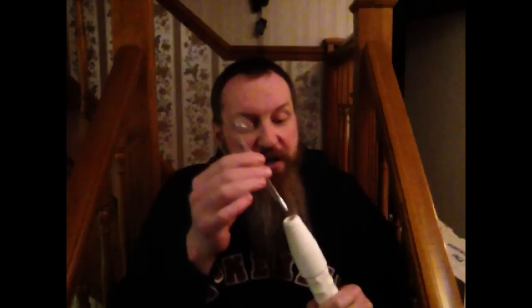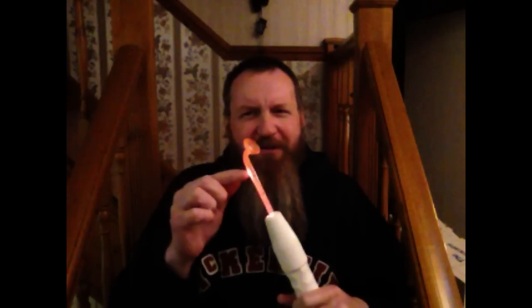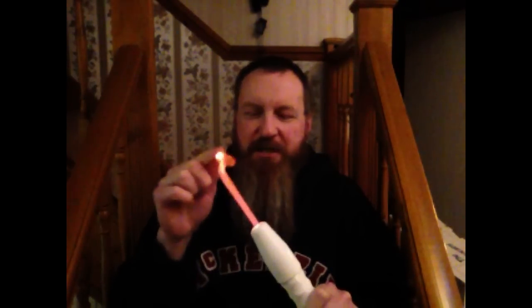And if I turn this down, this is a modern unit. I'll explain why this glows a dull purply shortly. Because this is one of the electrodes that came with this unit, and it's much more stylish. Oh yeah, that's much better. It's neon.